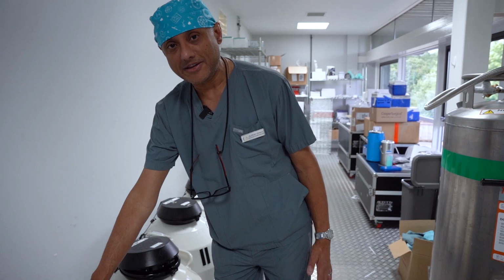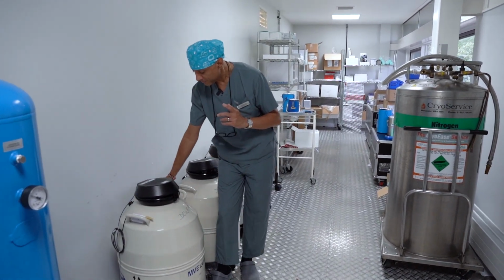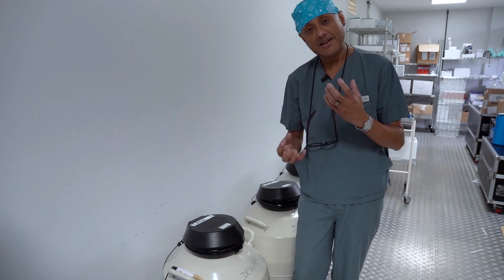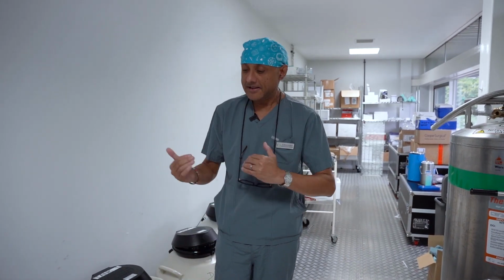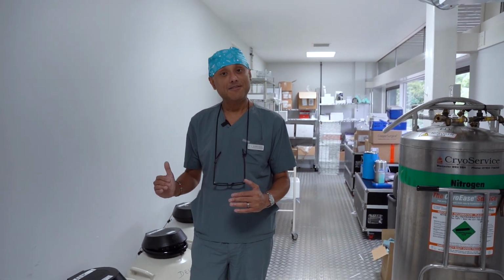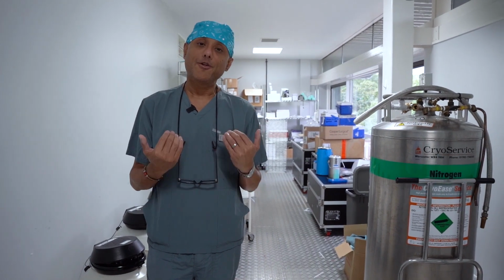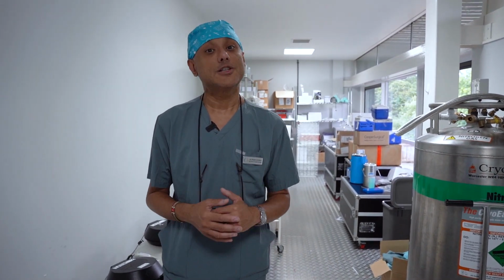These are the dewars that we store the eggs and embryos in, and all these dewars are full of liquid nitrogen. The system that I was talking to you a bit earlier on, which is the alarm monitoring system, these are the alarm levels that we have, and these alarm systems are taking temperature readings of the liquid nitrogen in there every 5 minutes. And whenever the temperature rises, or say if the liquid nitrogen level drops, this will send a text or a phone call to the 7 people who are on what we call the autodialer system. So it doesn't matter what time of day or night, if the levels go down, and this is where your precious material is stored, this alarm system will activate, and there are 7 people on that autodialer system who can be contacted. Hence, we're able to attend to any emergency relating to the storage of eggs and embryos.